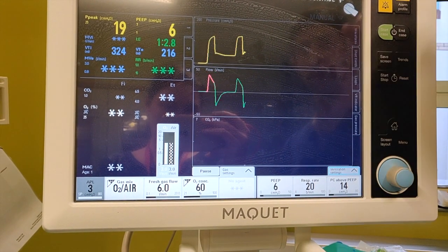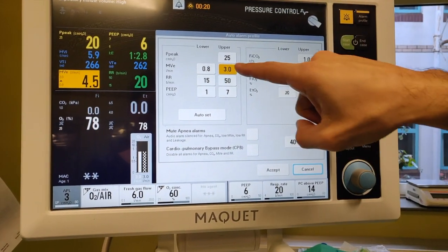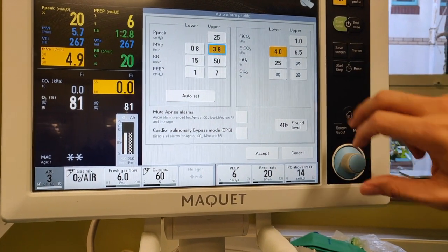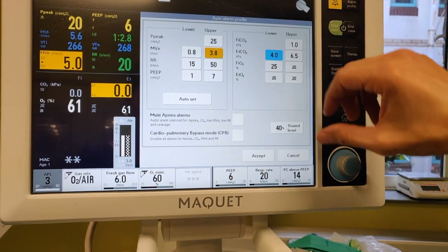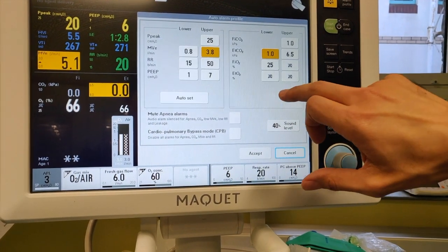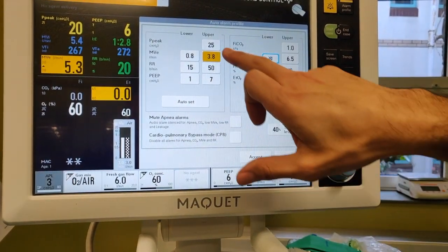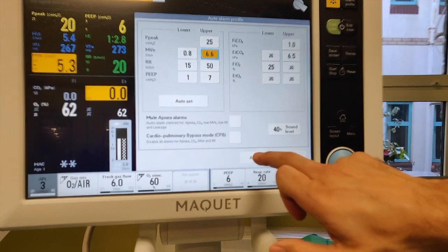The next thing that's going to happen is all the alarms are going to shout at you. So hit the alarm profile at the top and you can correct things that you want to correct. I've got no patient on the end of this at the minute, the end tidal is going to be low, so I'm just going to turn that alarm off to save our ears. And that will always come up. Accept.